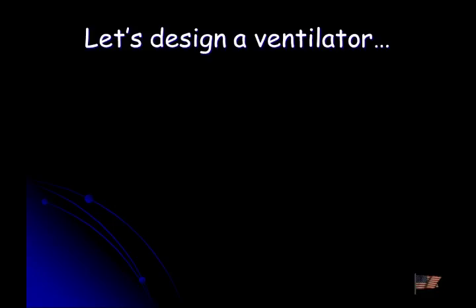So you need something as a mechanism to understand how fast, right? There's got to be some kind of mechanisms in there. And then you mentioned the chest rising and falling, so you need some feedback mechanism to be able to know that I've done the right thing. Okay. Isn't it pressurizing the blower? Well, in the case of non-invasive ventilation, the blower is the thing that's generating the pressure. But the thing that's generating the pressure when we squeeze the bag can be something totally different.